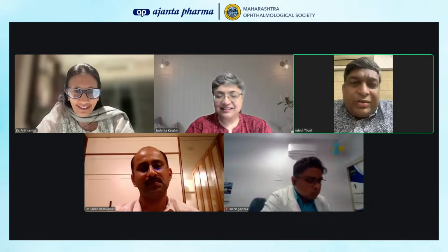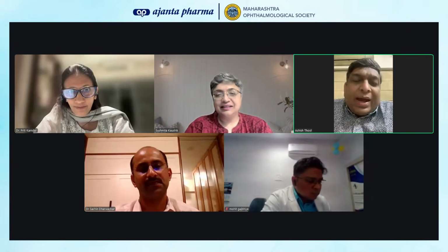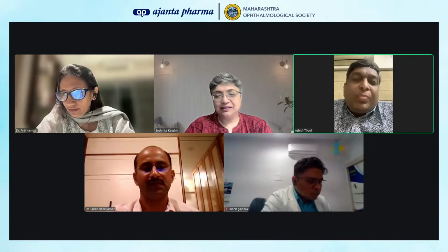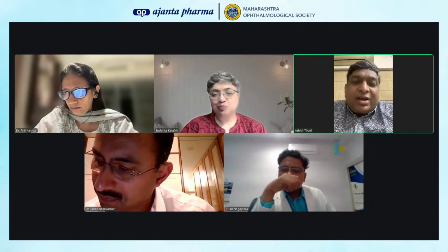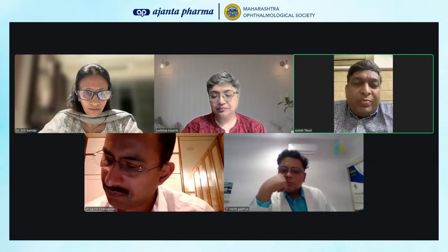Yeah, and a very valid question also, because anyway, myopia as a risk factor, we think in terms of glaucoma suspect, right? So many myopes you will want to assess as a glaucoma suspect. So we do both the things together. We'll do the fields, we'll do the basic glaucoma workup, we'll do the OCT, both RNFL as well as the GC-IPL, keeping in mind that the image acquisition could be a little difficult as compared to other regular discs, and having a good baseline is what I would be more concerned with.